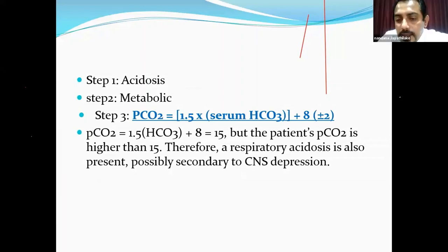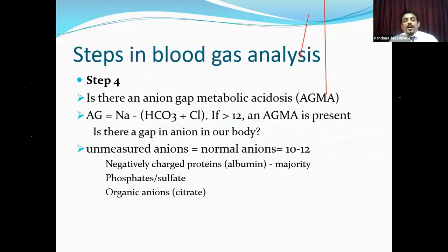So this patient has taken alcohol up to the level of developing acidosis. Acidosis in a coma patient. So now we have discussed 3 steps with 2 examples. Now this fourth step, which is not difficult. These all are simple steps in blood gas.